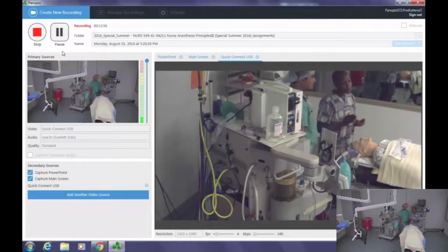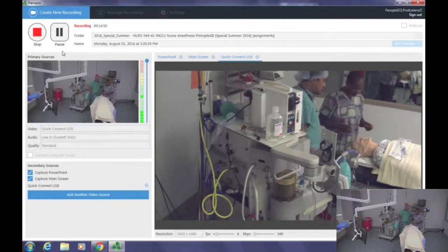You can have general anesthesia without the epidural or with epidural, but you can also have TIVA as an alternative to general anesthesia with tracheal intubation. So our plan is general anesthesia with tracheal intubation. Let's go ahead.